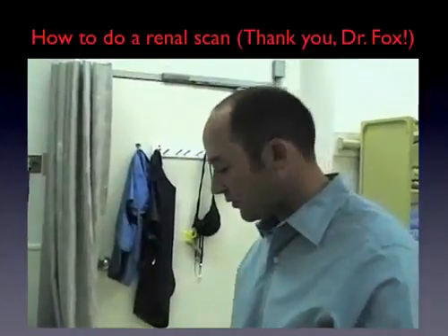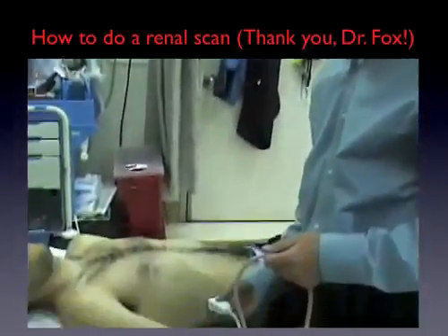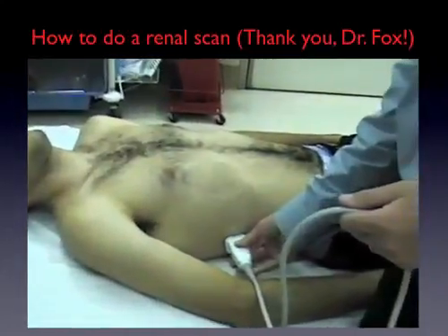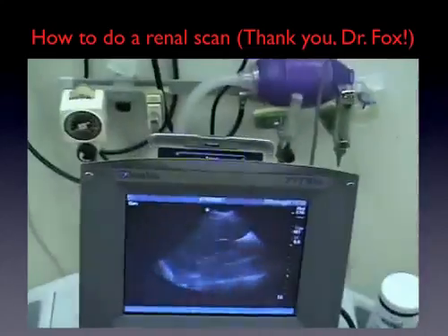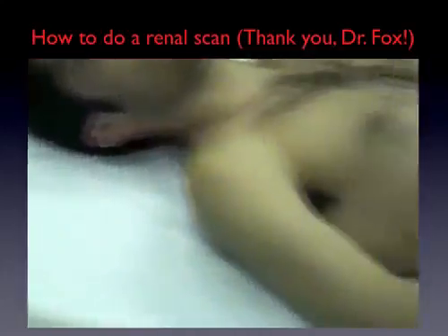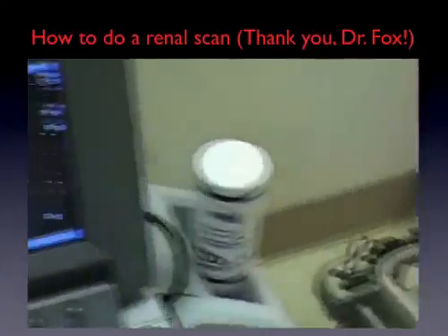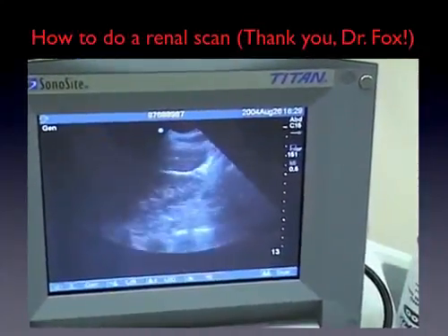Now, if we talk about the renal scan, you pretty much did one during the FAST exam, but you come over here, and you get a nice coronal view of the kidney. You can actually get the kidney upper pole and lower pole on the screen at the same time, in a long axis. And if you rotate the probe 90 degrees, towards the ceiling, you get a short axis of the kidney, fanning through. You always want to fan through an organ in both its long and short axis.